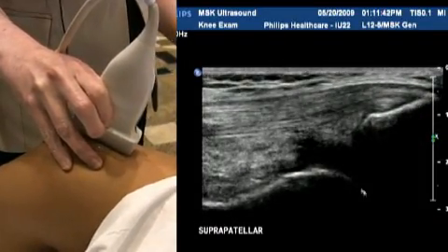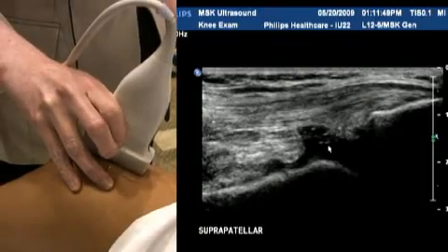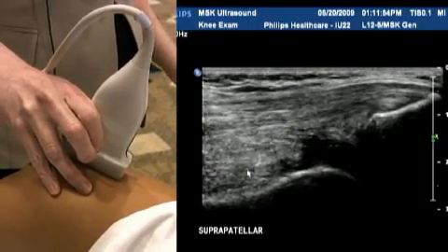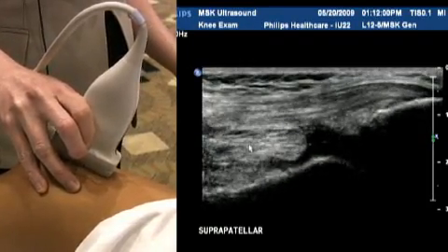Below in the suprapatellar fossa there's a small amount of fluid here and that's quite normal — most people have a little bit of fluid. When it gets to an excessive amount, that would be called a suprapatellar effusion, and that's certainly something that ultrasound can guide a needle to drain.